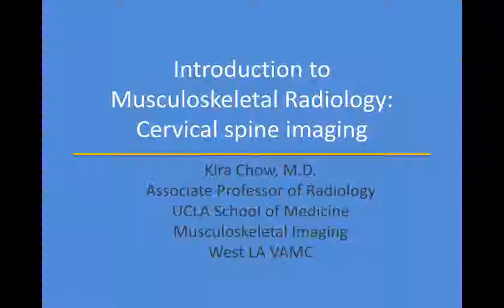I am a bone radiologist, so I was going to talk to you guys about cervical spine imaging today because I think that's something important that you guys will see in the ER. Patients who come in with trauma, and certainly neck pain is a huge thing that you will see in your clinic as well. But mostly we're going to focus on trauma today.